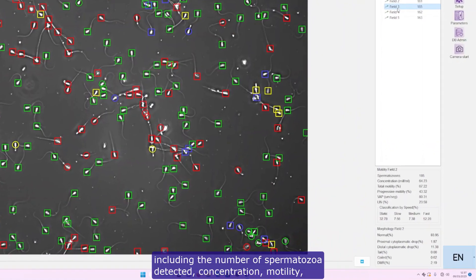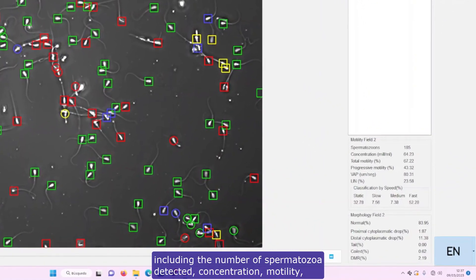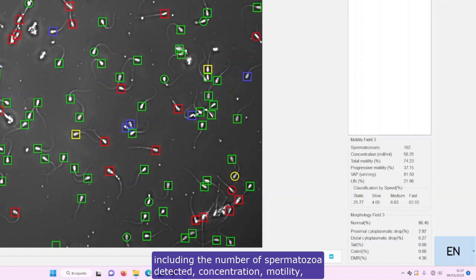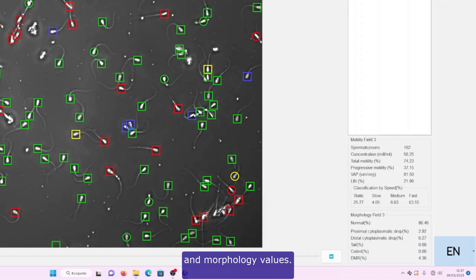including the number of spermatozoa detected, concentration, motility, and morphology values.